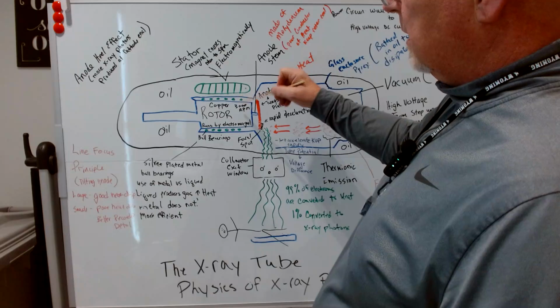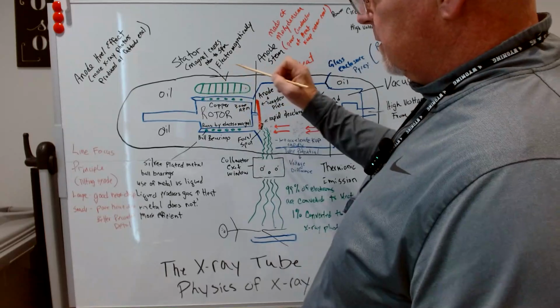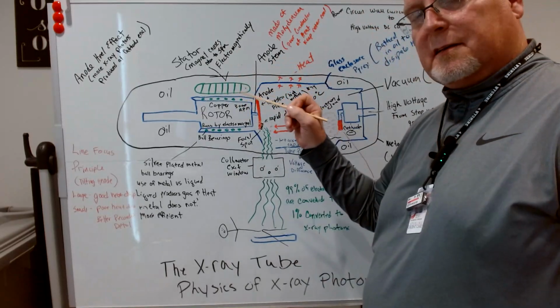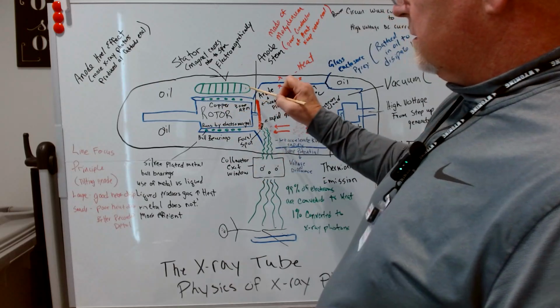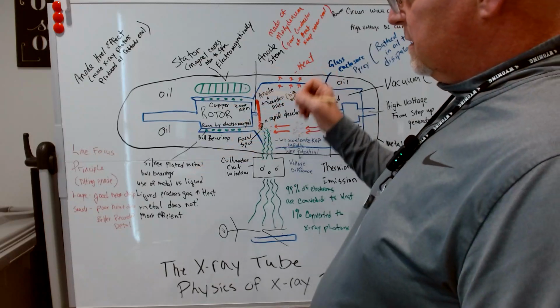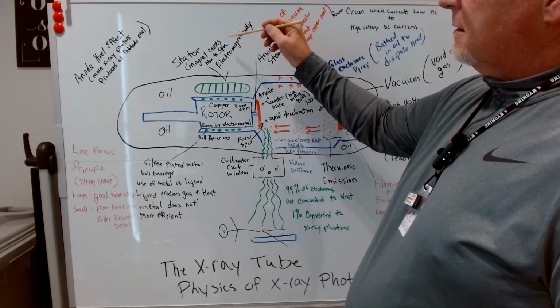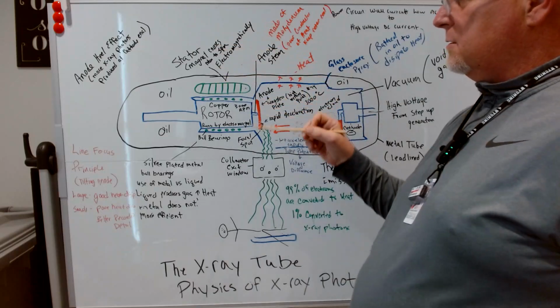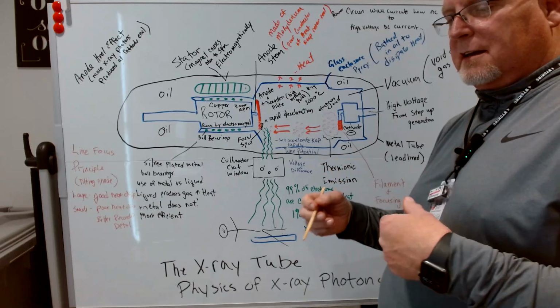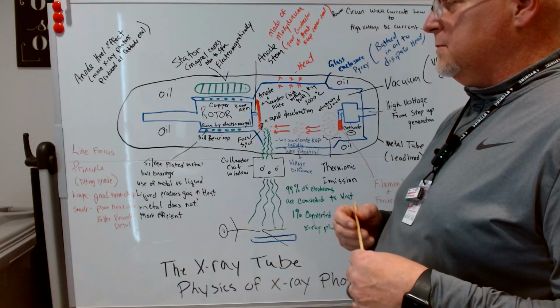Now how does that rotor turn? This green thing, which my daughter thinks looks like a caterpillar, but it's not. It's actually called the stator. Something you'll need to know, S-T-A-T-O-R, stator. It's some magnets that actually use electromagnetic energy to turn that rotor 3,000 times a minute.